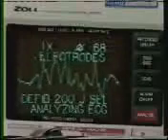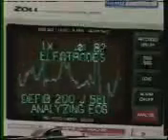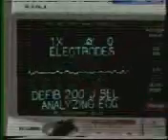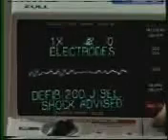It is important to stop CPR and avoid contact with the patient from this point on so that external movement of the patient or cables will not affect the rhythm analysis nor caregivers get shocked. If the ZOLL 2000 detects either ventricular fibrillation or a ventricular tachycardia in excess of 150 beats per minute, the messages shock advised and press charge will be alternately displayed.